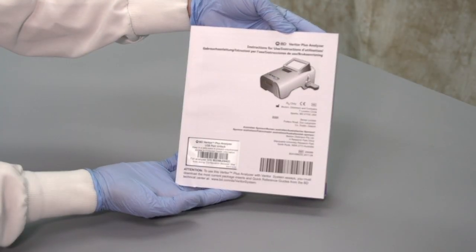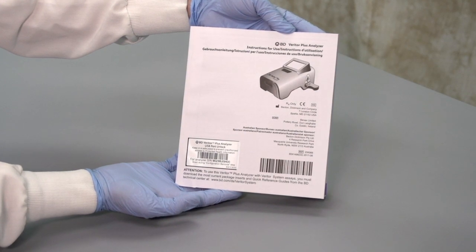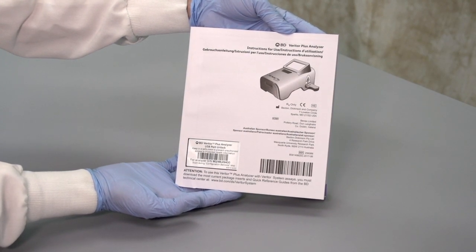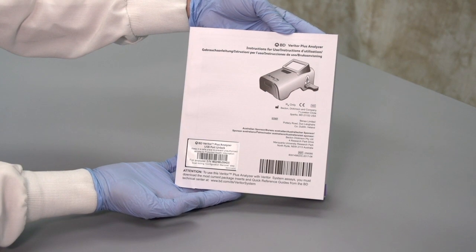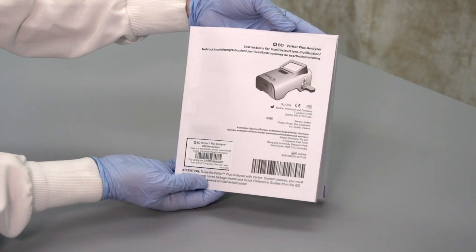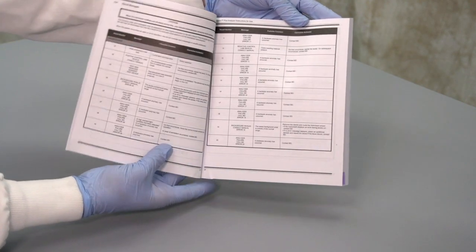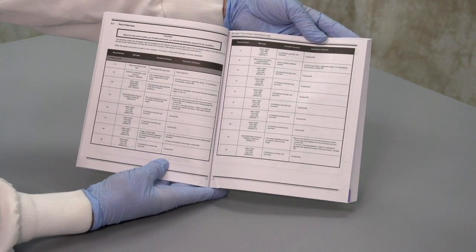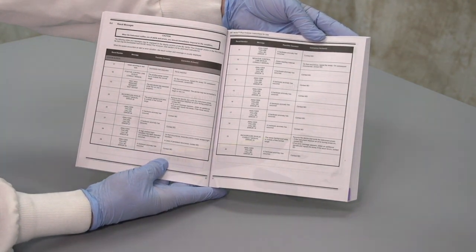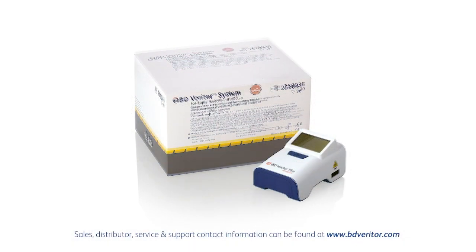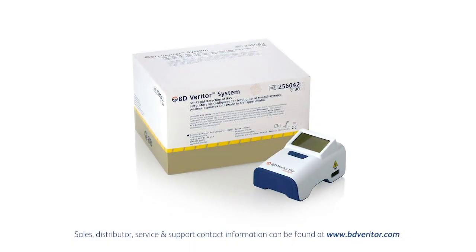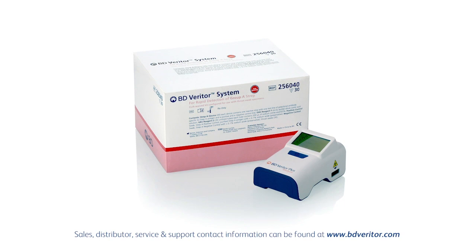The BD Veritor Plus analyzer is easy to maintain and troubleshoot. Note, it comes with an instrument lifetime warranty, 3,500 tests, or two years usage, whichever comes first, and is supported by BD Global Technical Service and Support. Please refer to the Instructions for Use booklet for additional information or troubleshooting guidance.